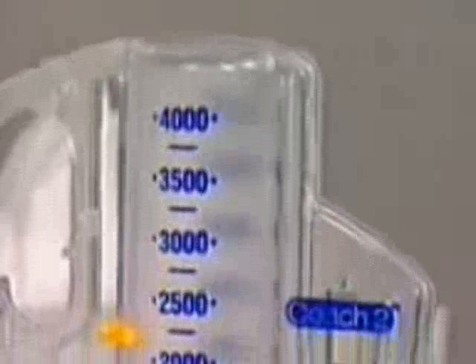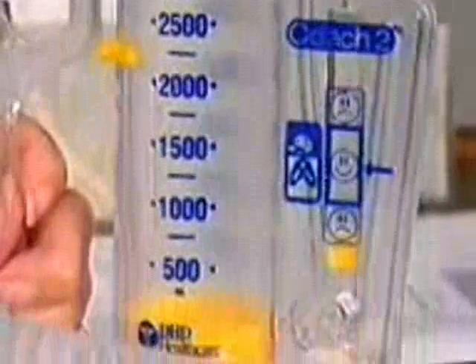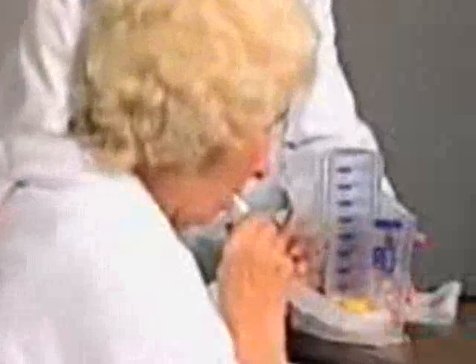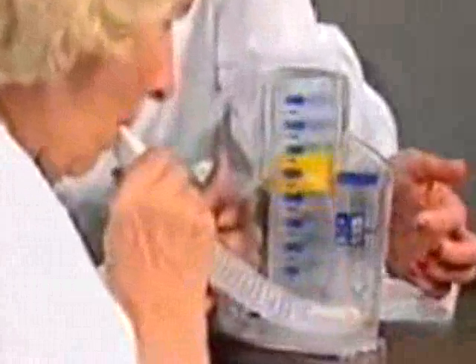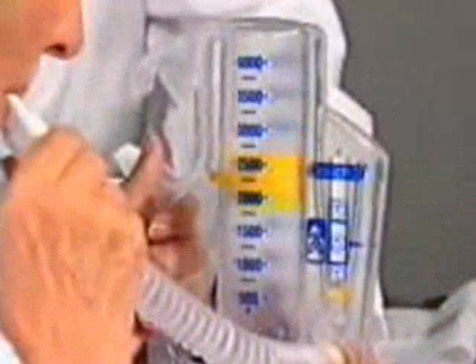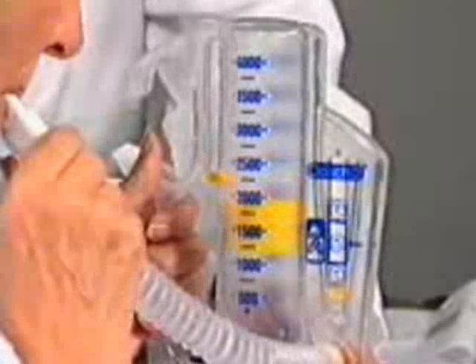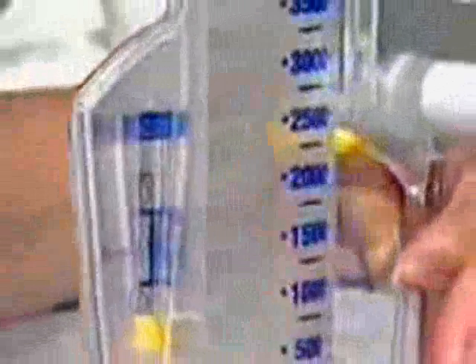When you look at the COACH II, you will see a series of numbers on the device. As you inhale through the device, the large piston rises, indicating the volume of air you inspire. Measurement of the volume you inspire should be taken from the top of the yellow piston as it moves past the calibration markings. The calibration markings are on the back side of the device as well, allowing your clinician to easily monitor your progress.